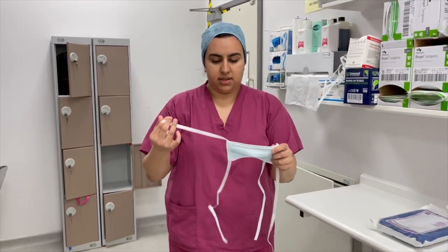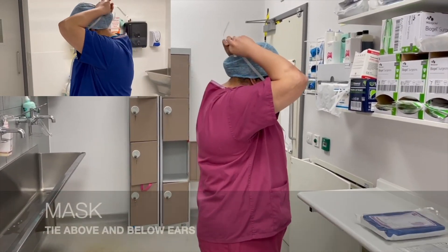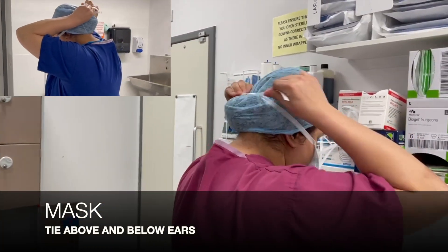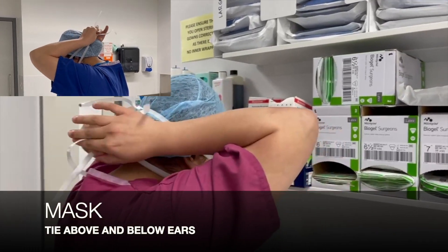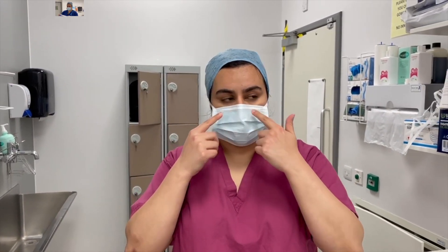This is the mask — it has an upper tie and a lower tie. We're going to put this on and tie it at the top, making sure that it's well secured, not too tight, then secure the lower edge, and press it on the nose making sure that it stays in place.